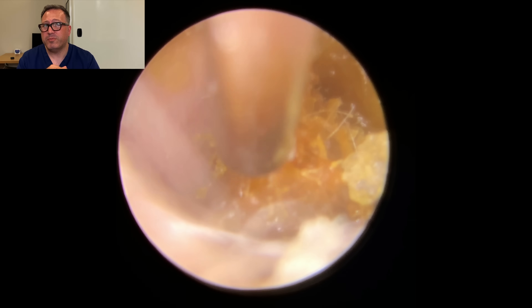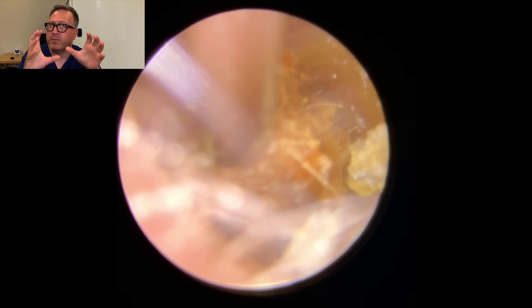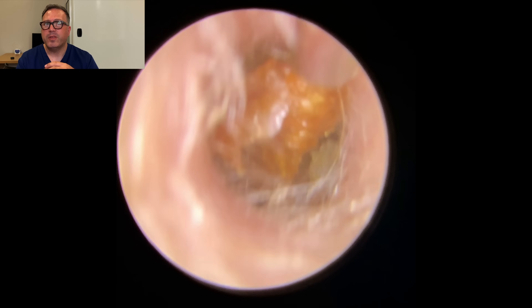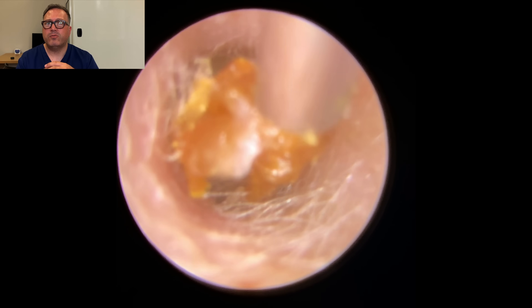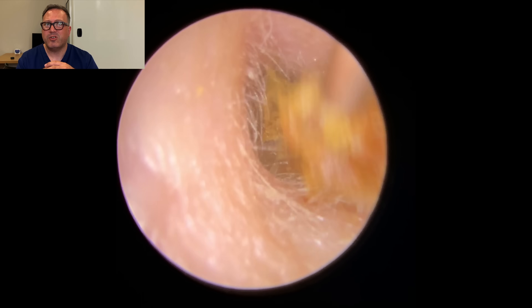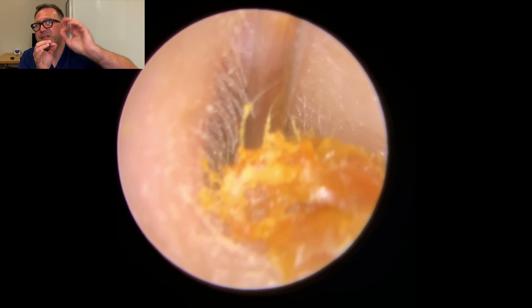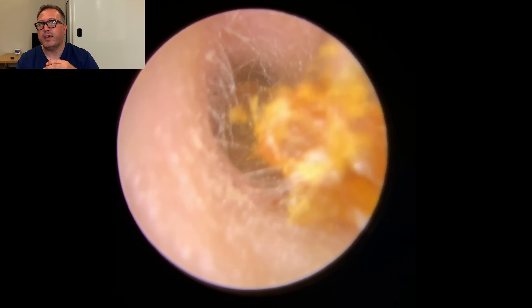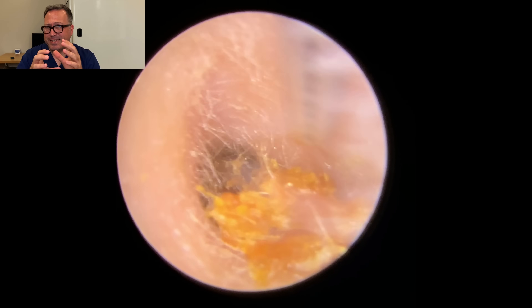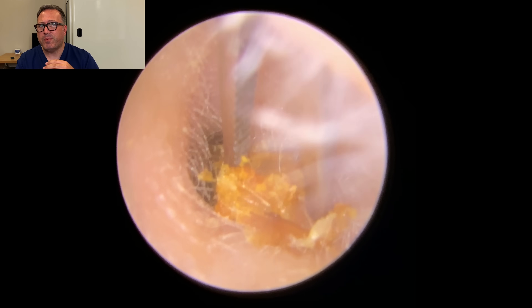Normally, if the canal had accommodated it, we would have gone in with the standard size tube — a little bit wider, better grip — but we just didn't have the room in here unfortunately. So we've got a good grip there, a little bit of wiggling to get this out of the canal. You can see this is still connected to the wax behind — look how it disappears off into the ear canal. This is one big piece, so we're going to use the crocodile forceps to get a good grip on this outer section.